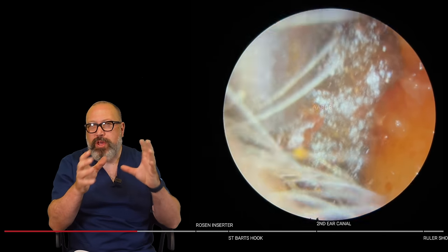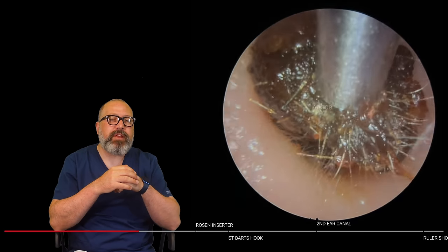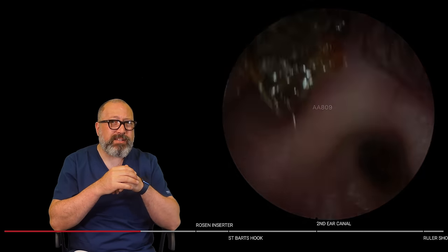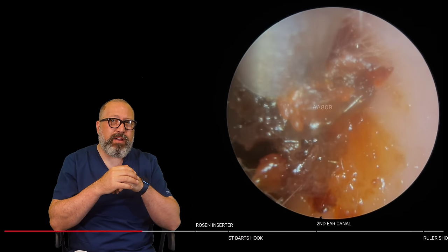Really having to work it, not only down the canal, but twist it as it gets to the entrance of the canal to get this out. But we're still going in here. There is so much wax in this ear canal. It's literally chock-a-block from front to back. So it's really coming away now.